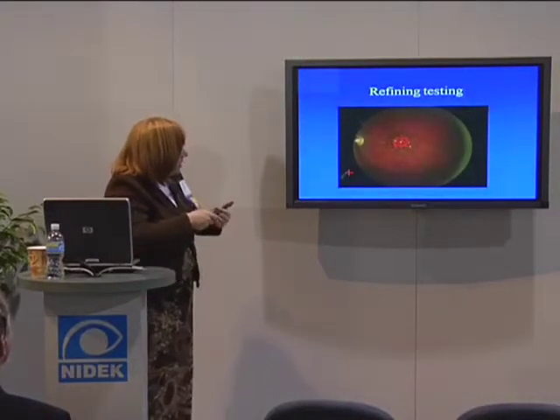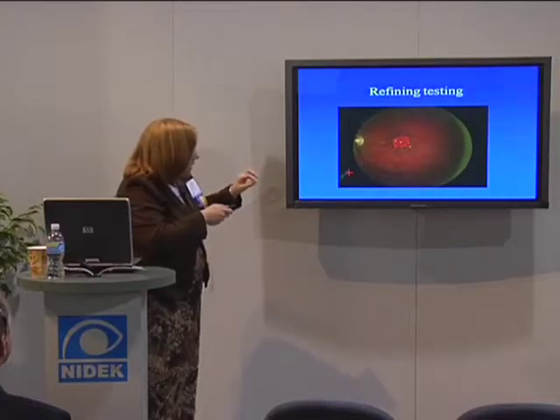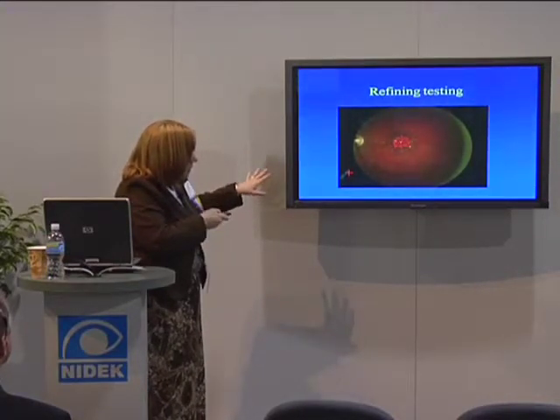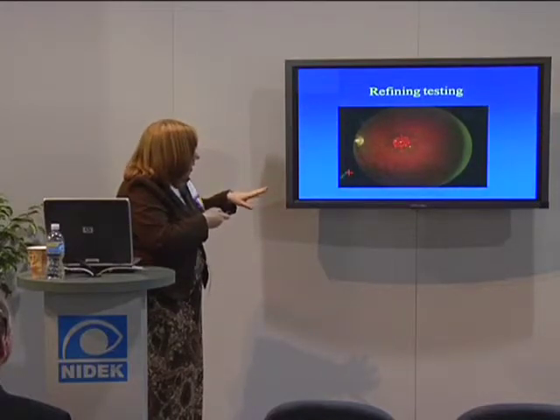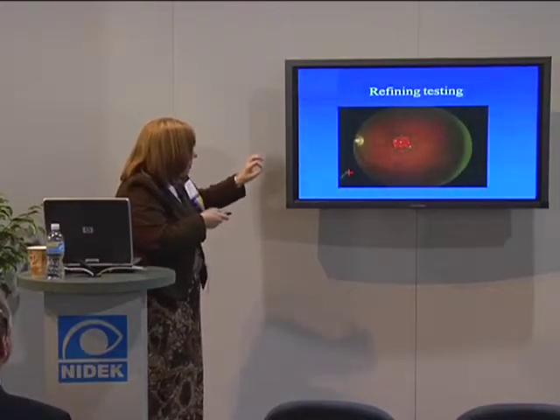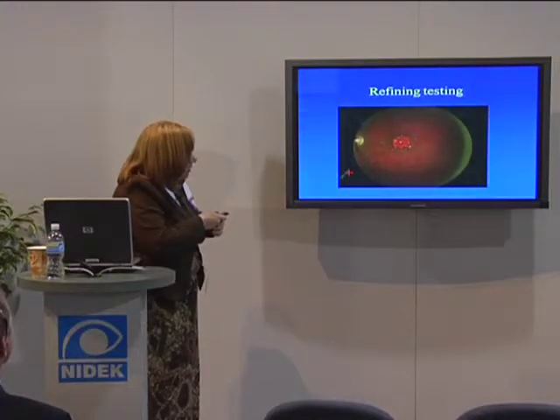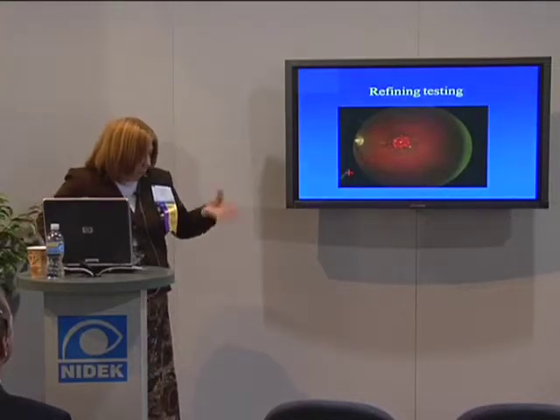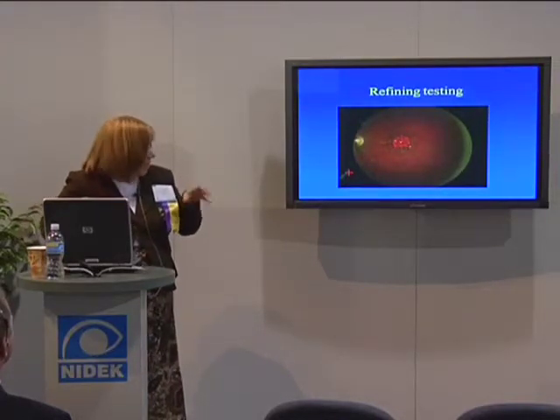But then so I had added those points to really identify it, and then I could come back in, removing the cross, so that the cross is now not there, and isn't potentially blocking off or interfering with the perception of the stimuli, and then I could map it more effectively. So the semi-automated plot gives me a feeling of where there are problems, and then I can go back in and refine.